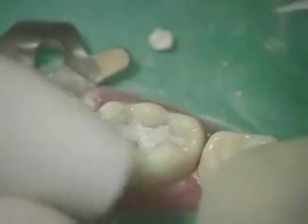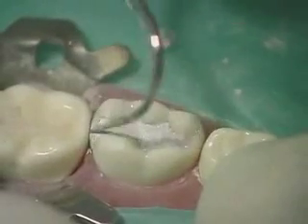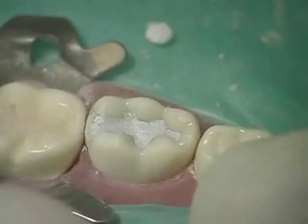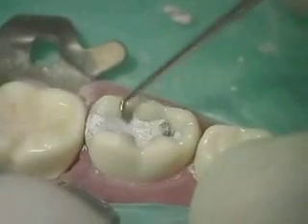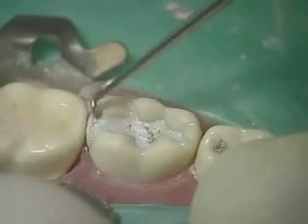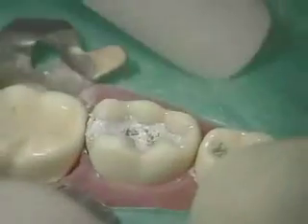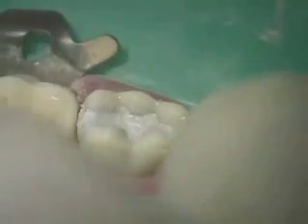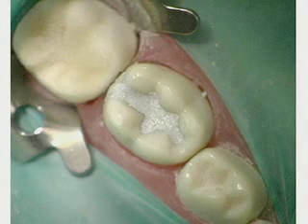Clean the proximal walls using an explorer to create an occlusal embrasure. Use a ball burnisher to put the finishing touches. The completed restoration should have the same outline form as the preparation and there should be no marginal excess covering the margins.